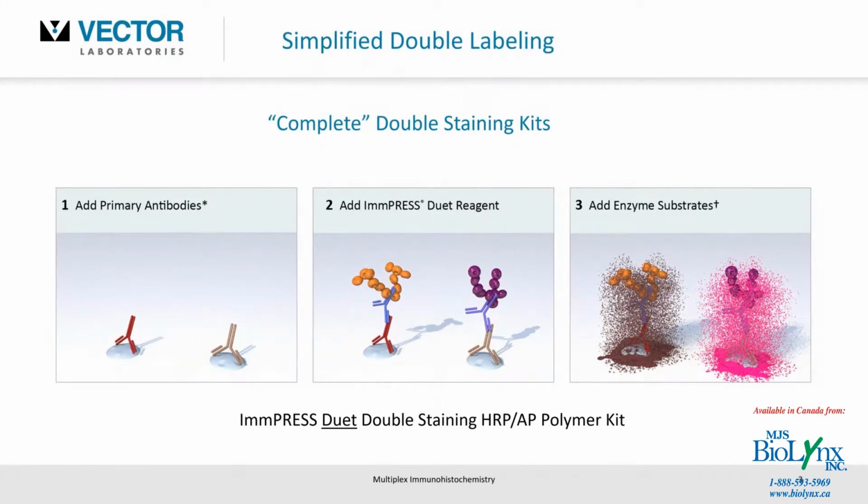And the caveats you need in order to do this easy double labeling would be using a human or indeed a non-human primate specimen, as in non-rodent. The two antibodies would have to be one raised from a mouse, one from a rabbit. You could mix those two together, and then you could apply this duet reagent, which is supplied pre-diluted, ready to use. They would bind to the respective primary antibodies, and then you develop those substrates independently. So this is double labeling in a single kit.